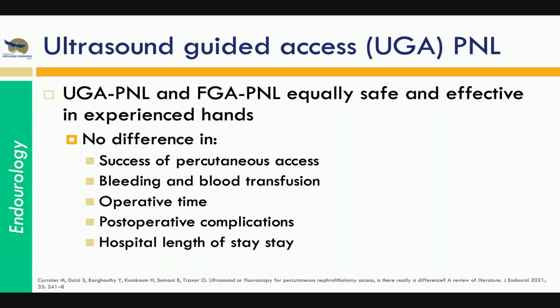But there are a number of studies that suggest that ultrasound-guided PNLs and fluoroscopy-guided PNLs are both pretty much equally as safe and as effective in experienced hands. This is a very large review of 12 articles, including 6 randomized controlled trials, as well as 3 meta-analyses. The global conclusion of this review was there's no difference in the success of actually obtaining the access, which I think is quite impressive.